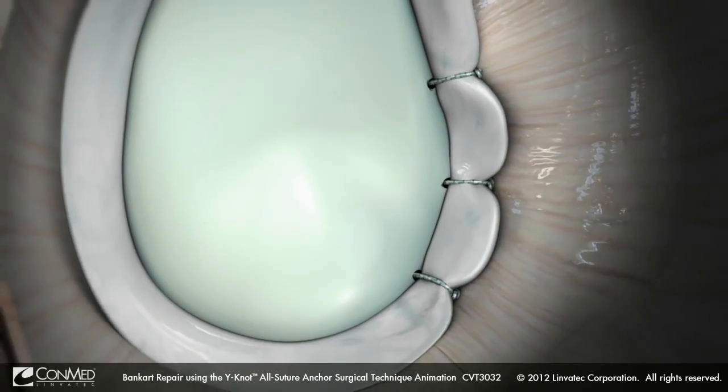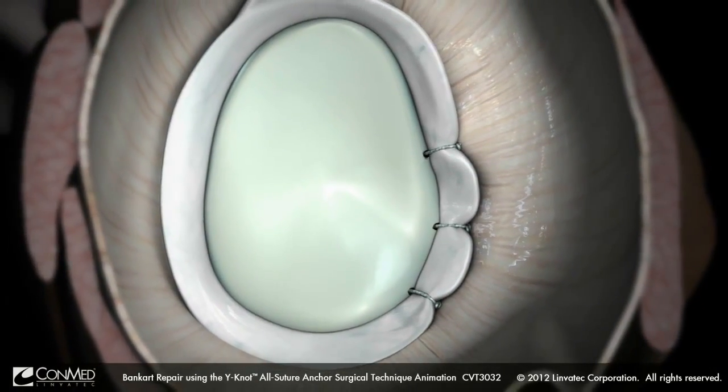Repeat steps utilizing additional Y-Knot anchors to complete the repair.